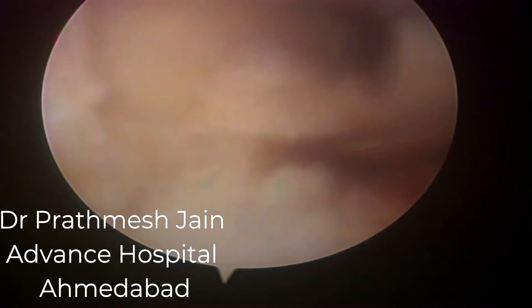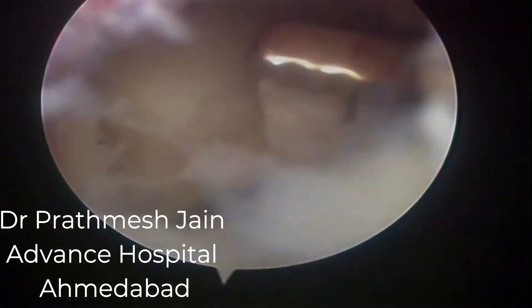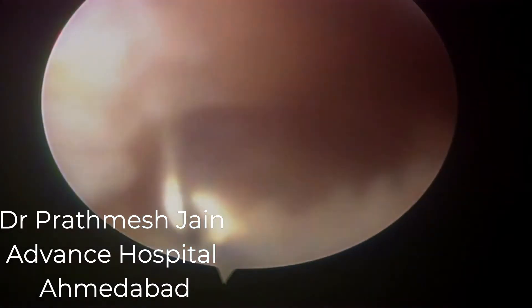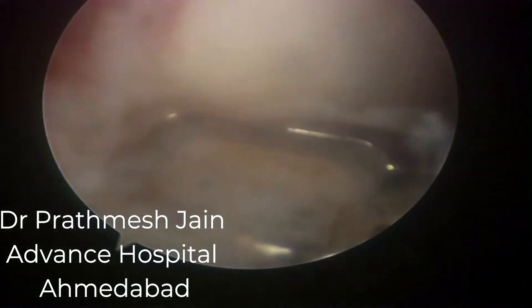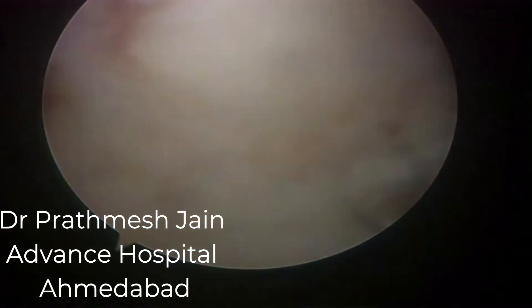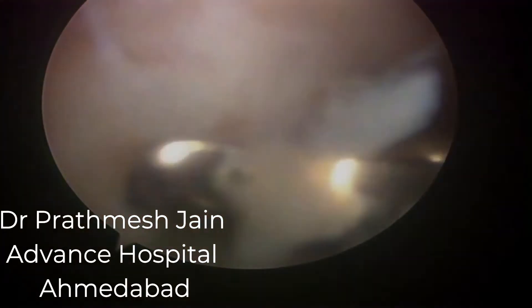Slowly we release the tissue in the medial and lateral parapatellar gutters as well. Here we can see that we are able to clear the intercondylar notch area much better compared to where we started at the commencement of the surgical procedure. Shavers are then utilized to remove the tissue.